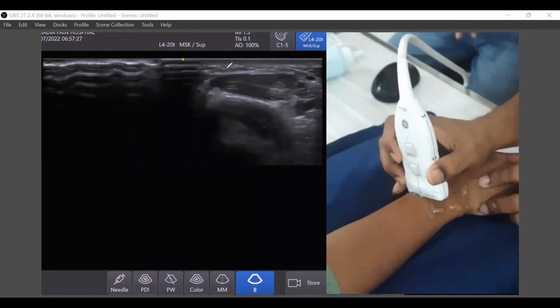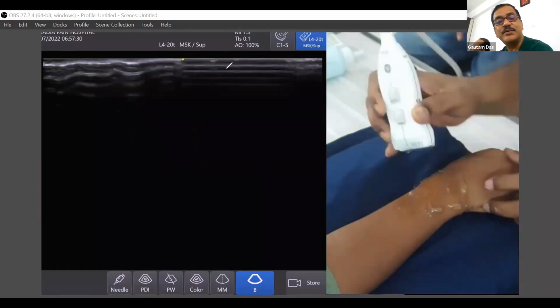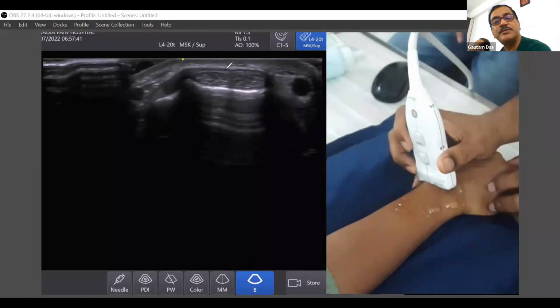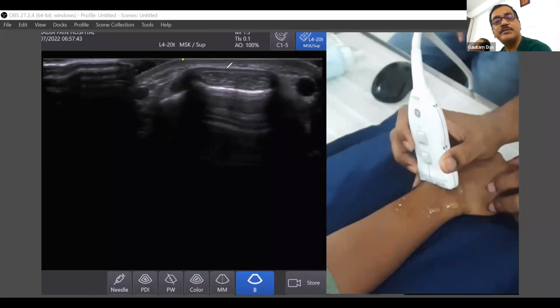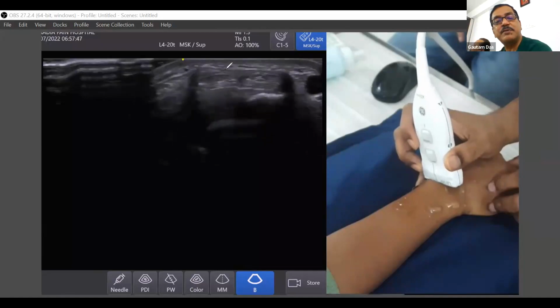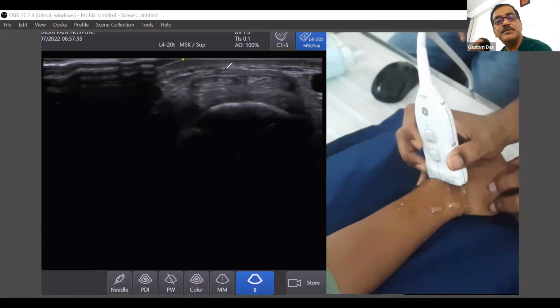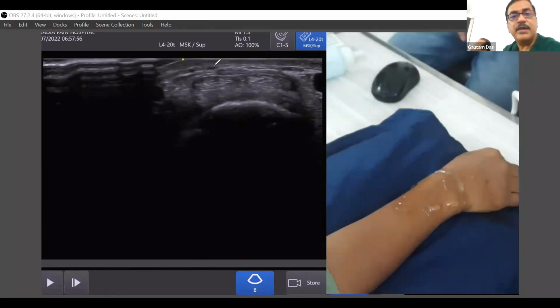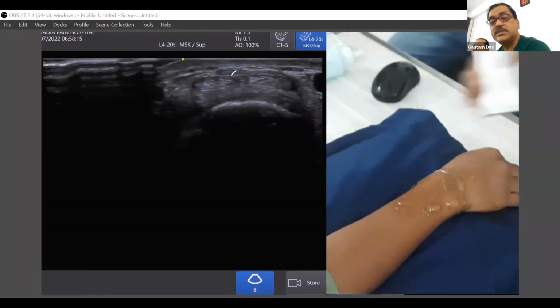Now if we are following these two tendons distally, this was the Lister tubercle again. These are the second compartment tendons. If I'm following this, see the third compartment, something is now coming from the ulnar side. This is the extensor pollicis longus. These are the two second compartment tendons, and this is slipping over it. So this is your area of the distal intersection syndrome.